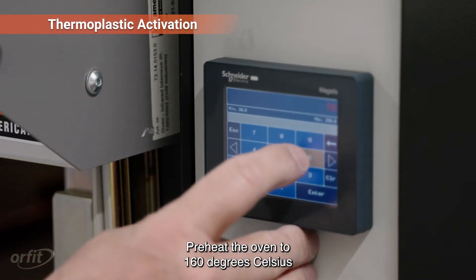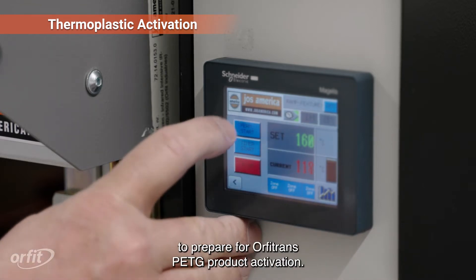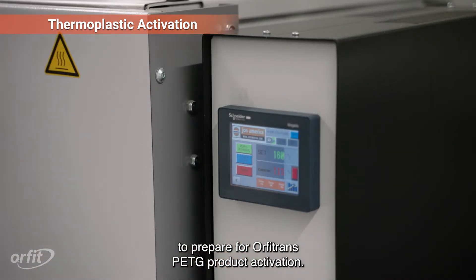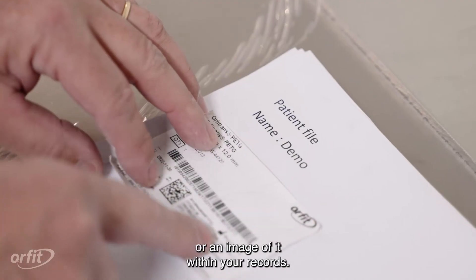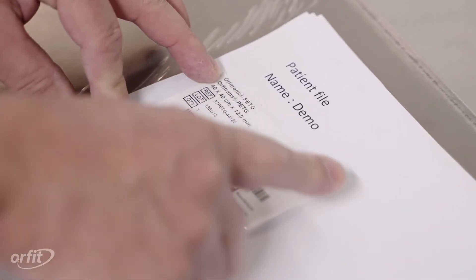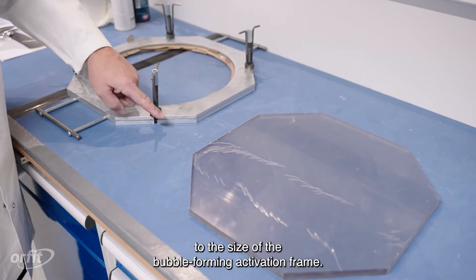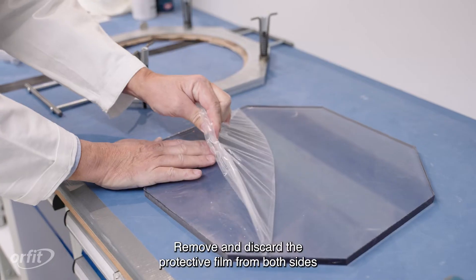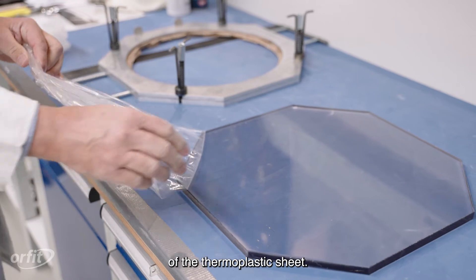Preheat the oven to 160 degrees Celsius (320 degrees Fahrenheit) to prepare for Orphatrans PETG product activation. Locate the label, remove it, and retain it or an image of it within your records. To prepare for bubble-forming, trim the thermoplastic sheet to the size of the bubble-forming activation frame. Remove and discard the protective film from both sides of the thermoplastic sheet.